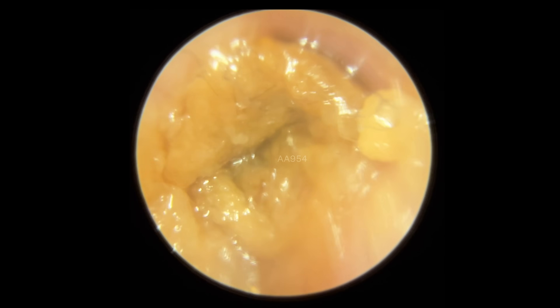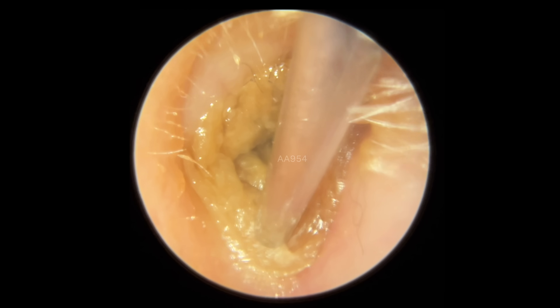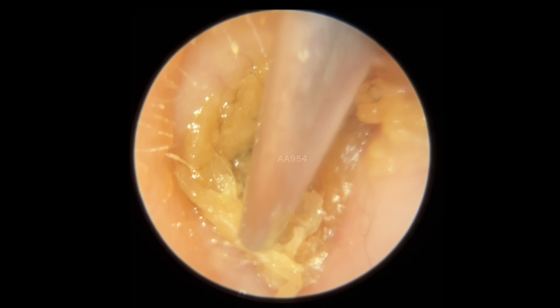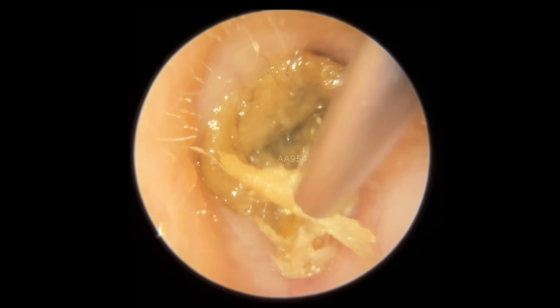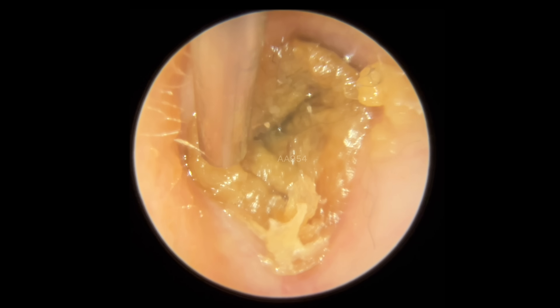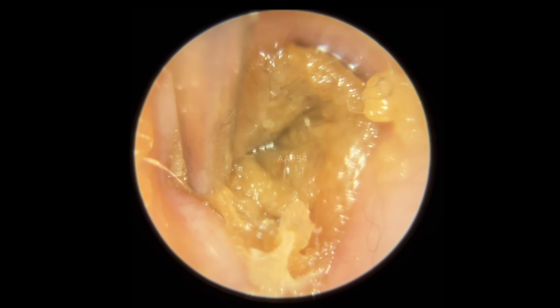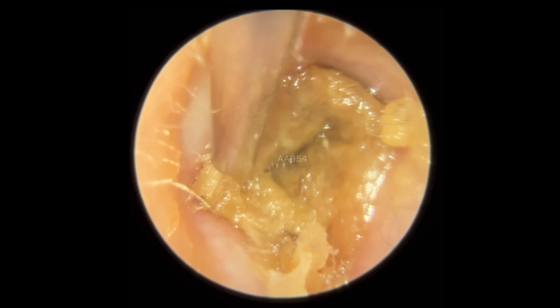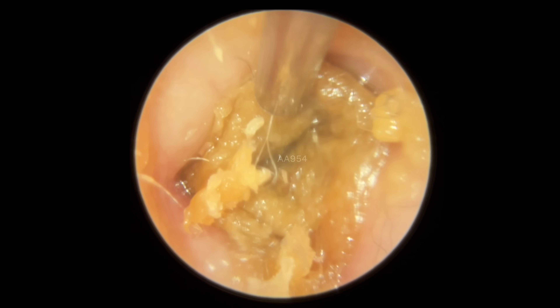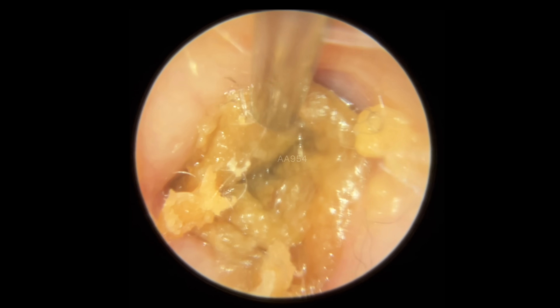When you first glance at this, I thought it was a wet squishy wax plug. But when you start to lift it up, you'll see this isn't wax at all — this is mostly skin. There might be a little nugget of harder wax in the middle, but this is mostly a ring of dead skin around the outside portion of the ear canal. We don't know at this point that it's actually a case of surfer's ear. If you've never heard the term before — surfer's ear is where the ear canal starts to lay down more bone underneath the skin. It's a benign bone growth, and you end up with these really bony lumps in the ear canal called exostoses.